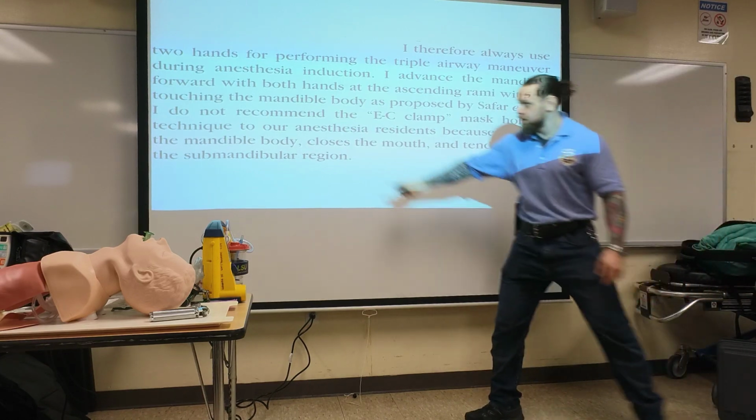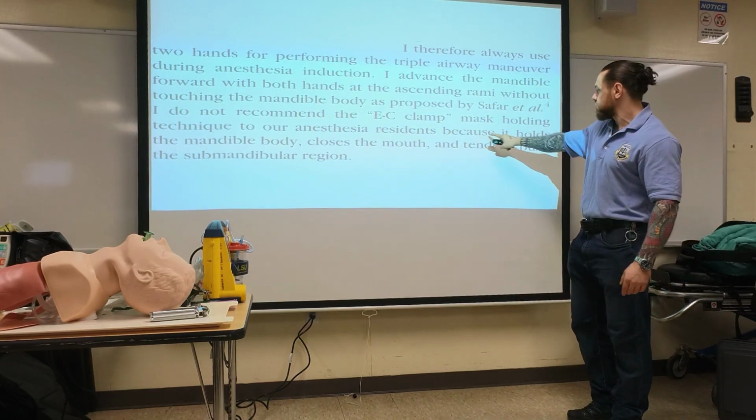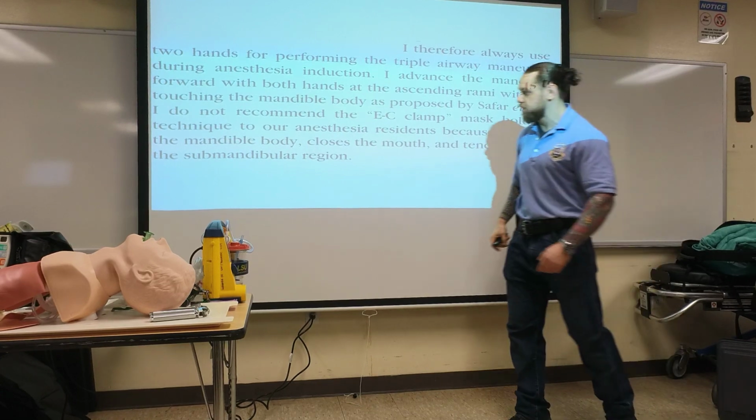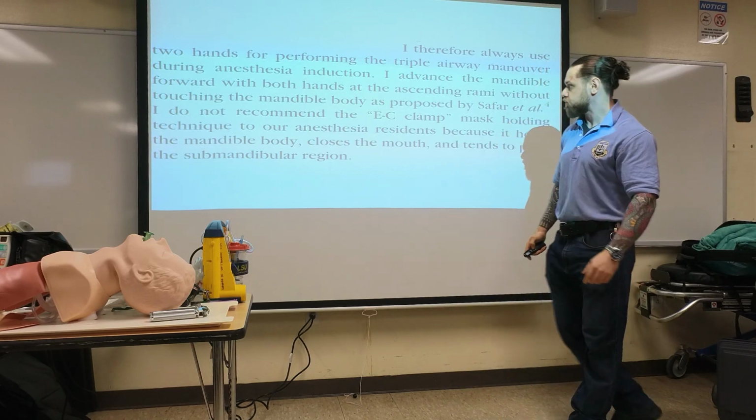And what did he say? I do not recommend the EC clamp mask holding technique to our anesthesia residents because it holds the mandible body, closes the mouth, and tends to push the submandibular region, and you have a lateral air leak in that.